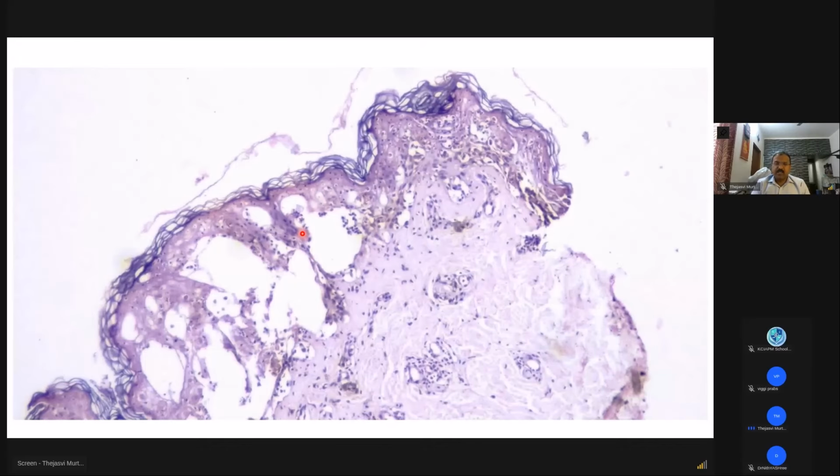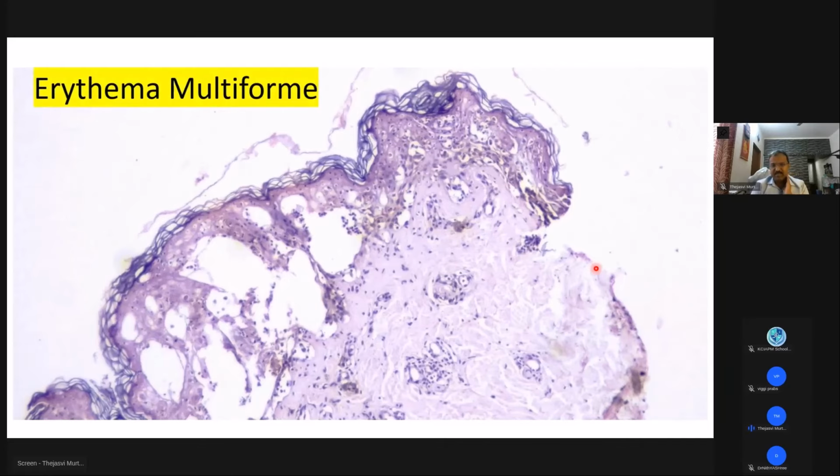You should be aware. So what is this now? So this is where you're seeing the epidermis is not at all intact close to the dermis. There is so much destruction in the epidermis, and it is difficult to make out nuclei over here in the lower part of the epidermis. It's a necrotic epidermis. It's almost lifted up and it is exaggerated. It's almost forming a bulla. So what could this be? This is erythema multiforme. This is drug induced, and you'll be seeing a lot.